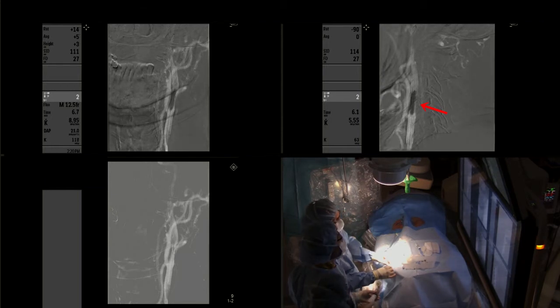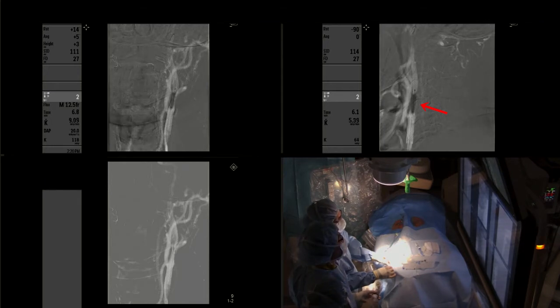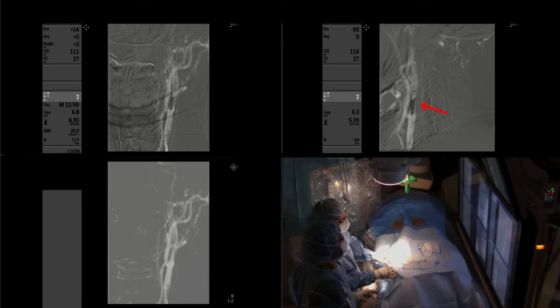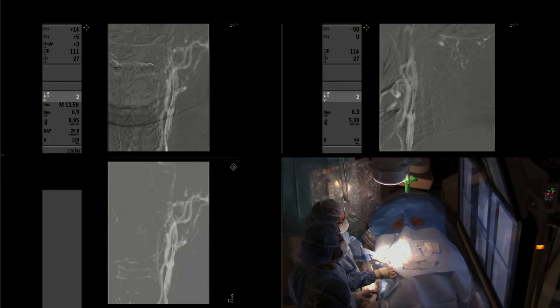We do balloon dilatation looking under fluoroscopy, always watching for any bradycardia or asystole which can sometimes occur due to the carotid body.